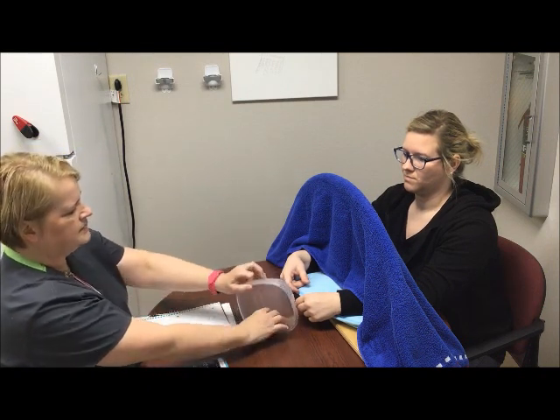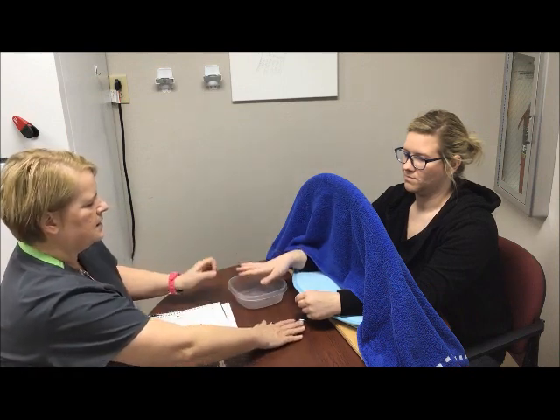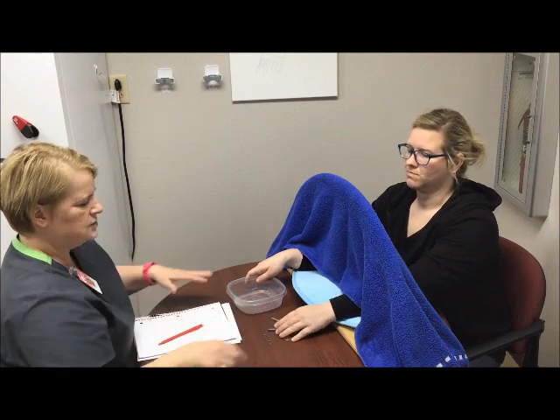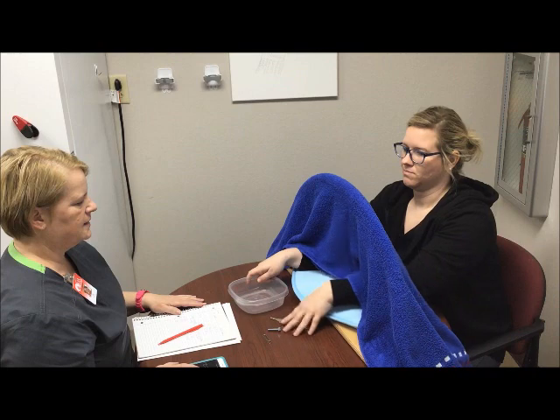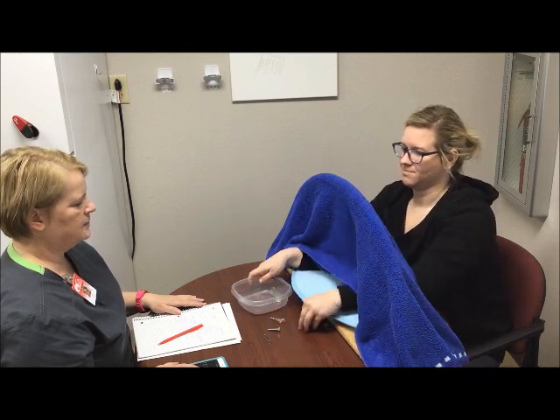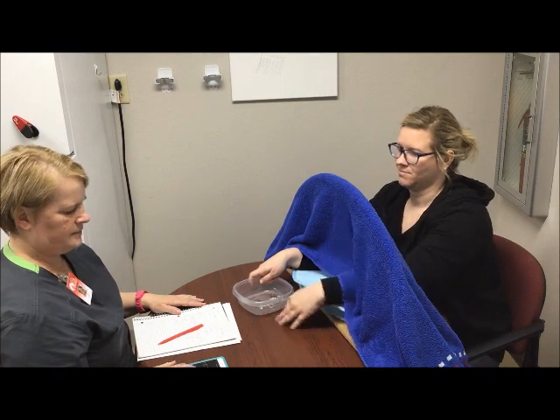Okay. This is the last time. Use your left hand — we've got one more time here. Got your container here and you can feel where they are right here within reach. Reset my clock. Okay, ready, go. Good. Excellent job.